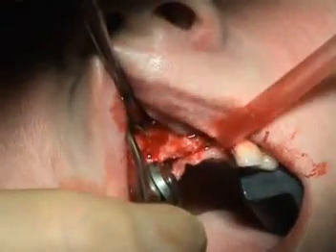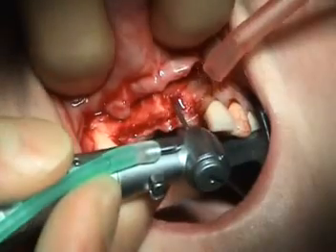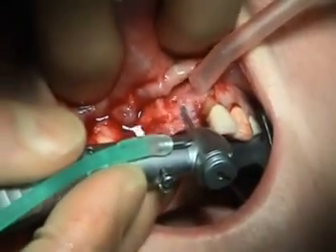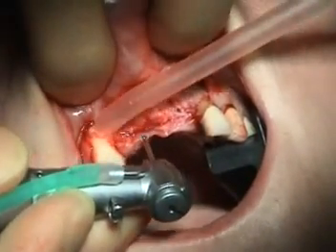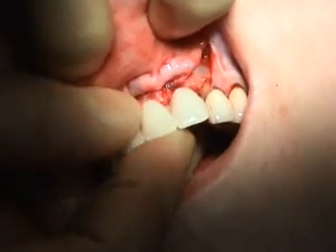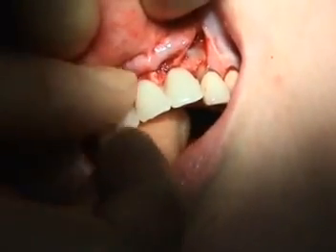As expected, the residual ridge width indicates the use of a particulate bone augmentation and concurrent implant placement. The initial sites for implant placement are prepared using internally irrigated implant burs in a speed-controlled surgical motor. In this case, the patient's existing temporary flanged partial denture is being used as a guiding template to assist with the implant placement.